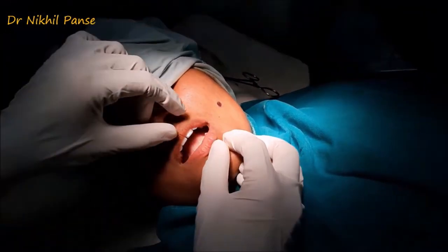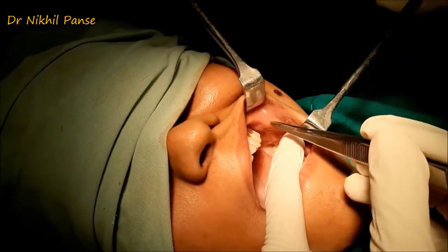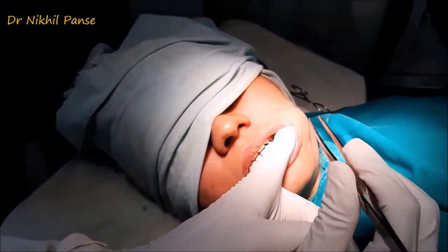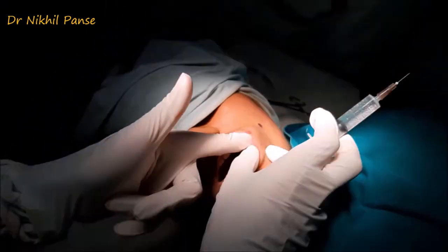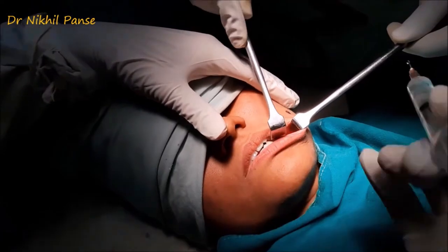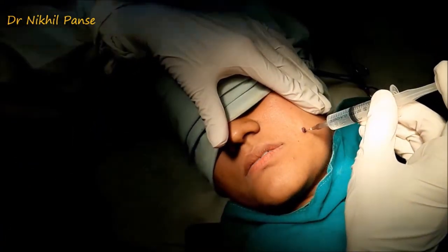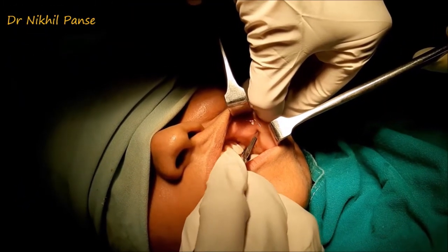When the proposed dimple is marked, we identify the Stenson's duct so that we accidentally don't damage the Stenson's duct during the procedure. Approximately 2 cm anterior to the proposed dimple towards the lip is our stab incision. So we infiltrate that area with lignocaine adrenaline solution, and also the site of the dimple is infiltrated. Then we wait for around 7 to 10 minutes and the procedure is begun.